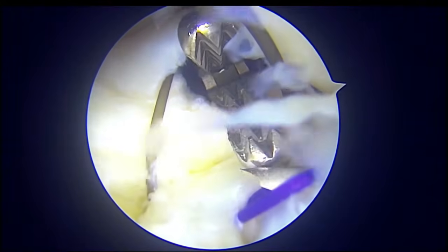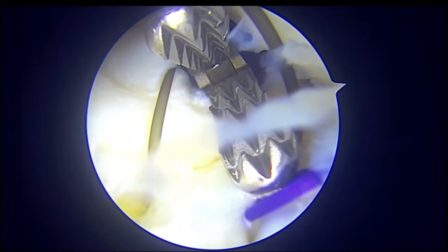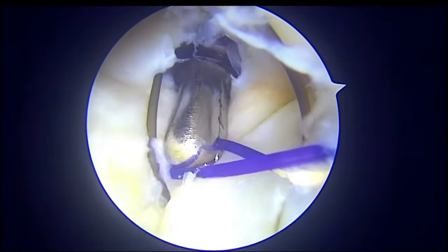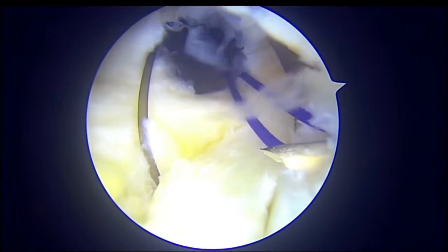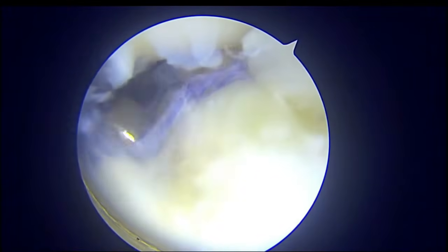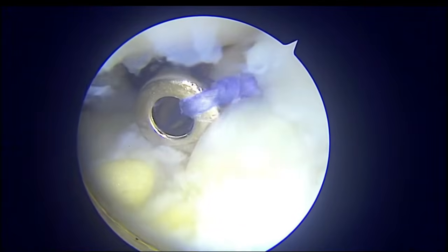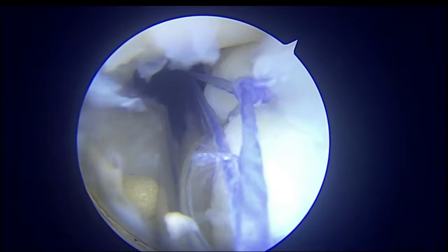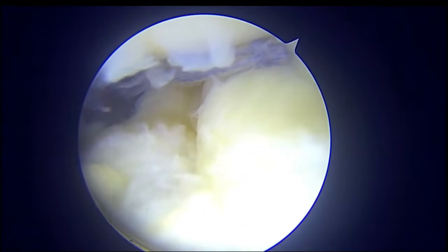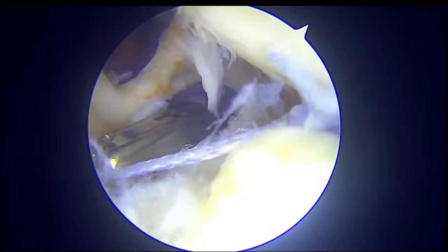And this is a posterior view. And I took the grasper and took the Prolene suture outside. So I have two sutures now in two of the limbs, and I am shuttling the sutures and tying the knot. This procedure also can be done with an all-inside suture, so that you can suture it from the anterior itself. After tying the knot, the excess material is cut away.